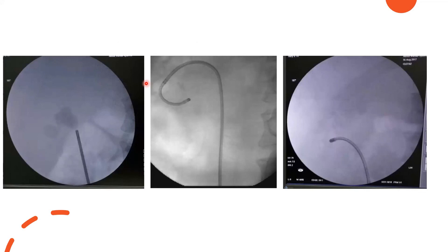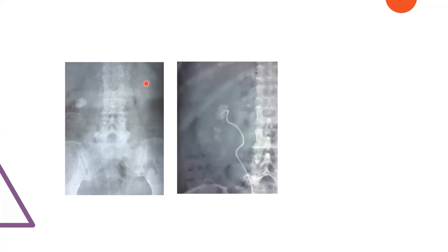Here is the stone, and we performed RIRS — retrograde intrarenal surgery. This is the final outcome. One more case: this is a bit smaller than the previous stone, in a 70-year-old lady, and we also performed retrograde intrarenal surgery on her. I like to show this because you might think there is residual stone — but after four weeks, the fragments were gone. It will be flushed out.